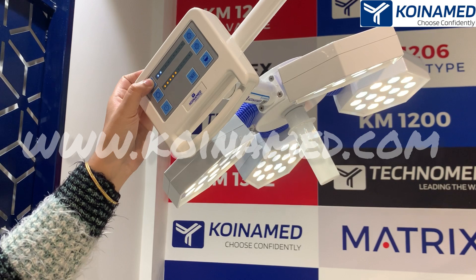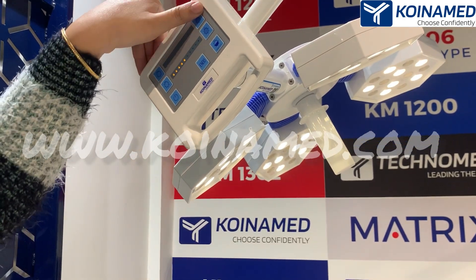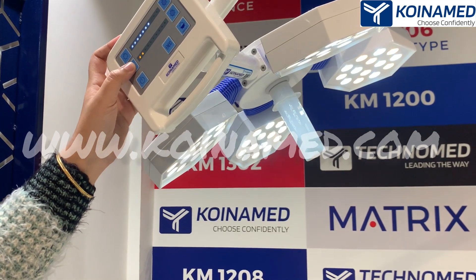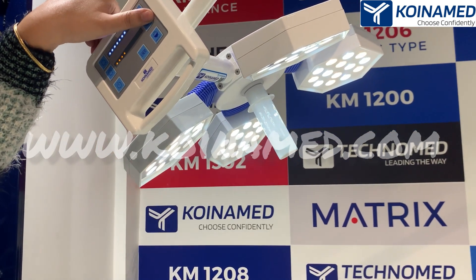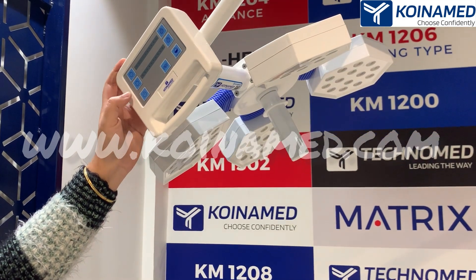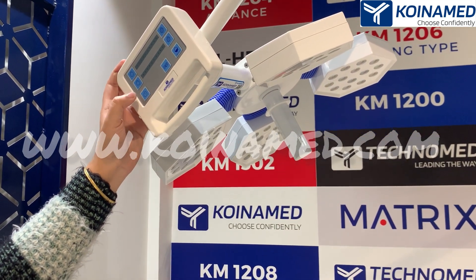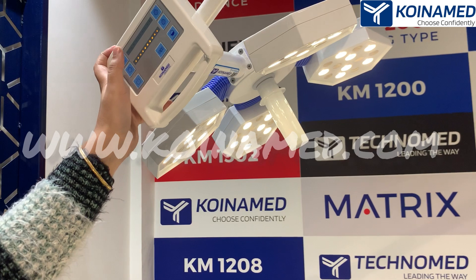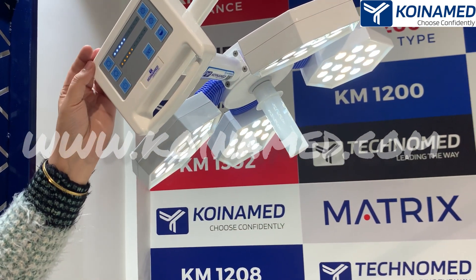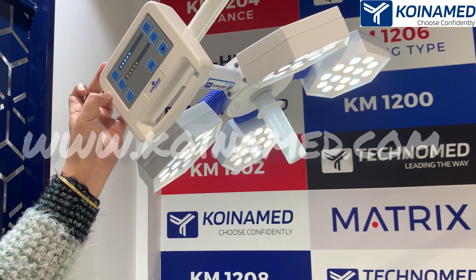From here you can decrease the white LEDs brightness and from here you can increase it. From here you can decrease the yellow LEDs brightness and from here you can increase it. With the power on and off button you can turn the light on and off. With the endo mode only yellow light will be lit up on the dome. With the preset feature you will get 50% white light and 50% yellow light.